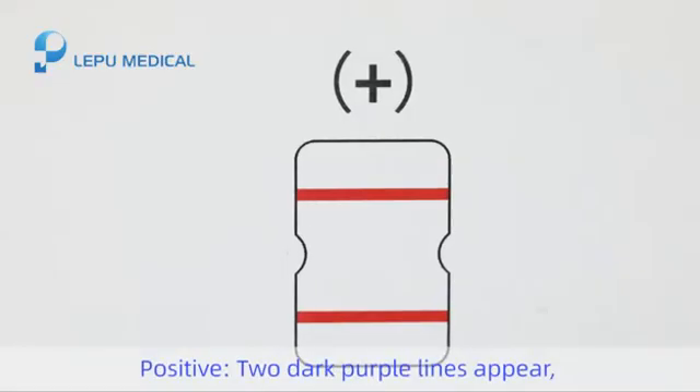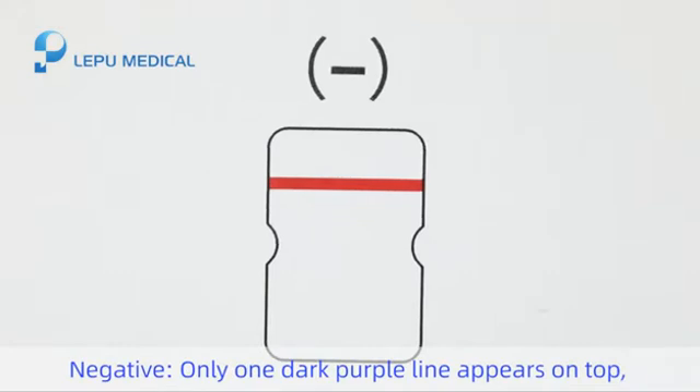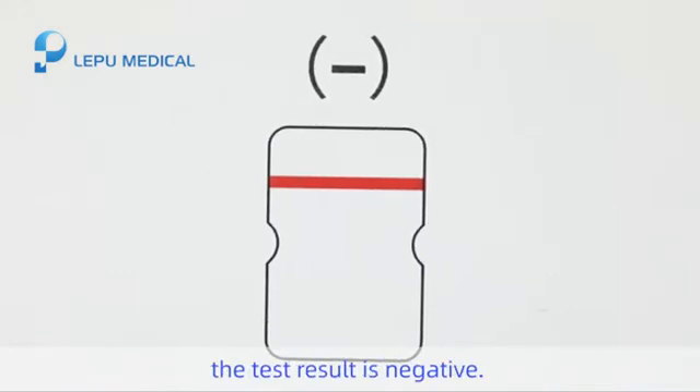Step 6: Result interpretation. Positive — two dark purple lines appear; the test result is positive. Negative — only one dark purple line appears on top; the test result is negative.